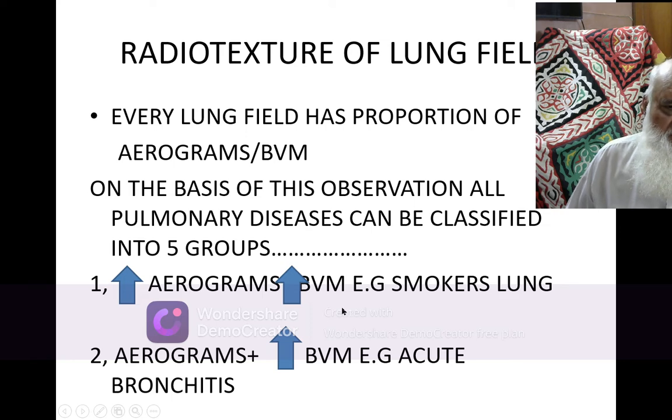When I examined the chest X-ray, I said that these are the lungs of a smoker. But he said, what are you saying? I said, sir, you are a smoker, therefore these lungs look like this. Can it increase this problem? Yes, of course. In 5 years you will become a COPD patient.